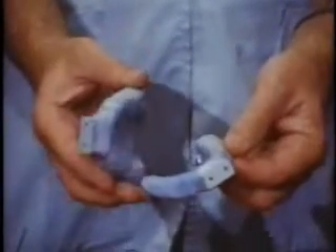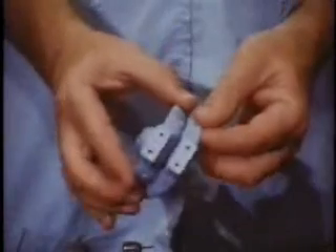The recording is performed with a specially designed experimental pantograph, which culminated six years of research effort. In order to attach the device to the patient's jaws, a set of custom-made plastic clutches are used.